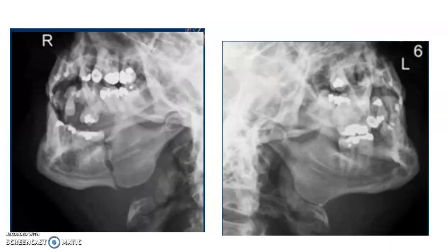This is just another anatomy picture here. This is showing an obvious fracture there. You can see these condyles really easily.